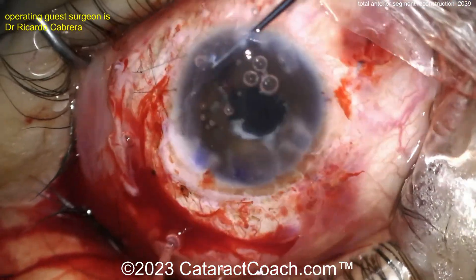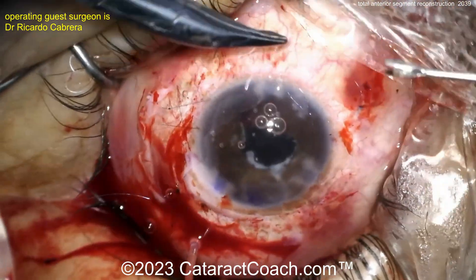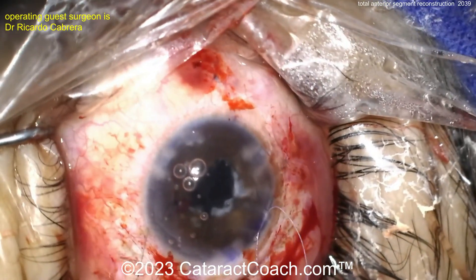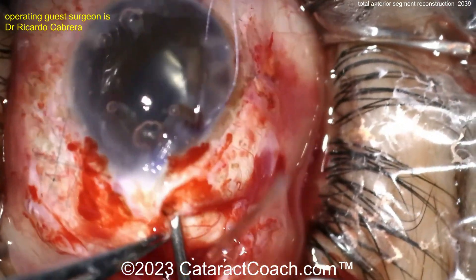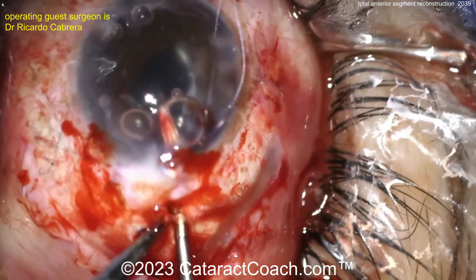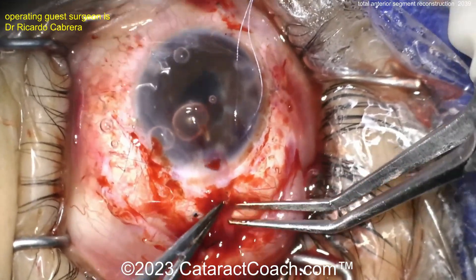If you're watching this and you're a young surgeon — yes, one day you can achieve this. But you better have at least a thousand cataracts under your belt before you even attempt this. This looks very easy, but our surgeon here, Ricardo Cabrera, is obviously a very experienced and very talented surgeon, because this case, I can tell you by looking at it, is very difficult.